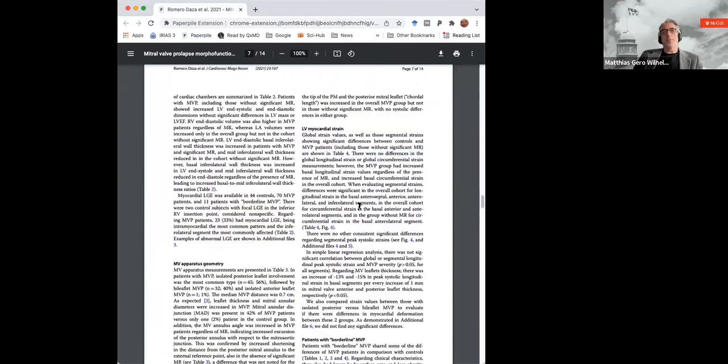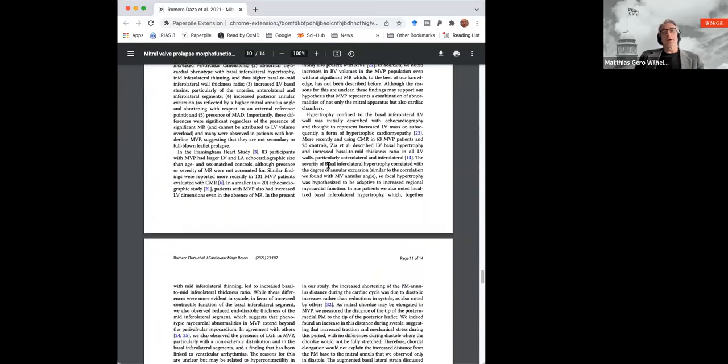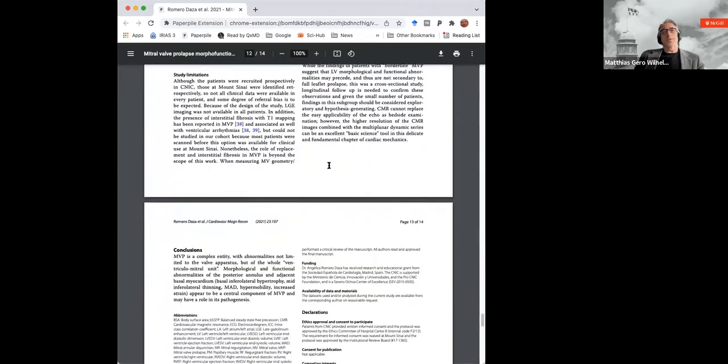So when you talk about the motion of the plane, what they're doing here, then you of course have to really know what you're actually talking about. Let's say the base of the leaflet, of course, stays at the place, it cannot move, but the visual appearance looks like there would be a disjunction, so that the whole mitral annulus would move in an opposite direction than it usually does. So these are some interesting aspects here, which deserve attention.